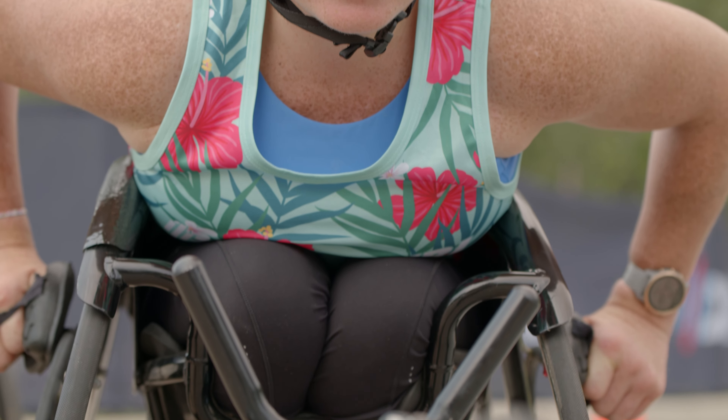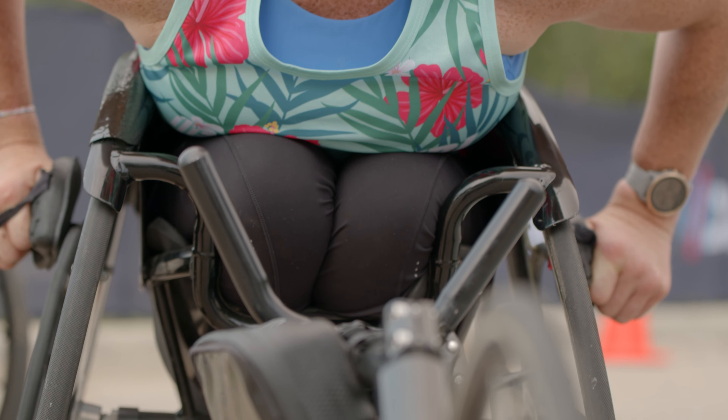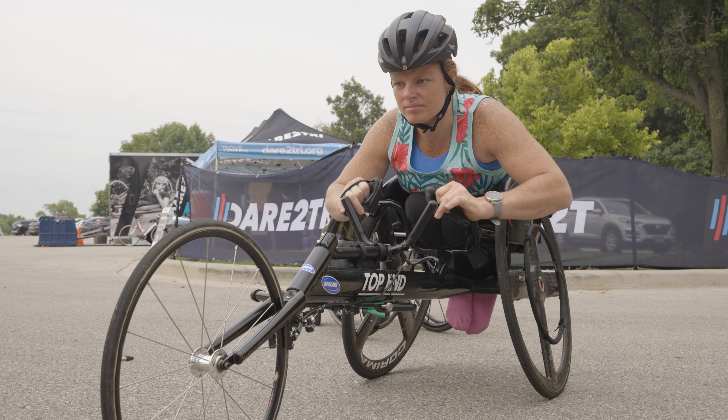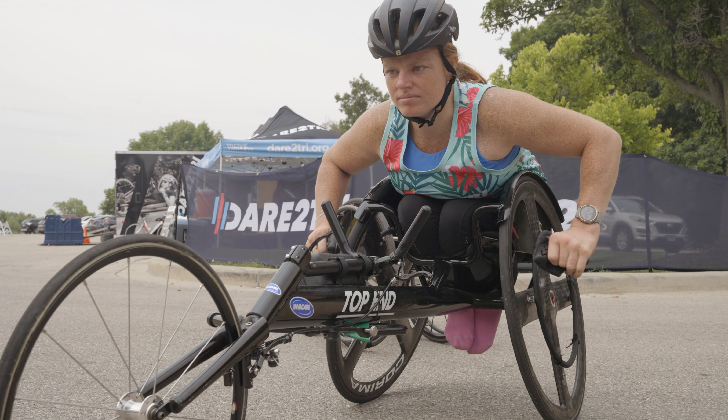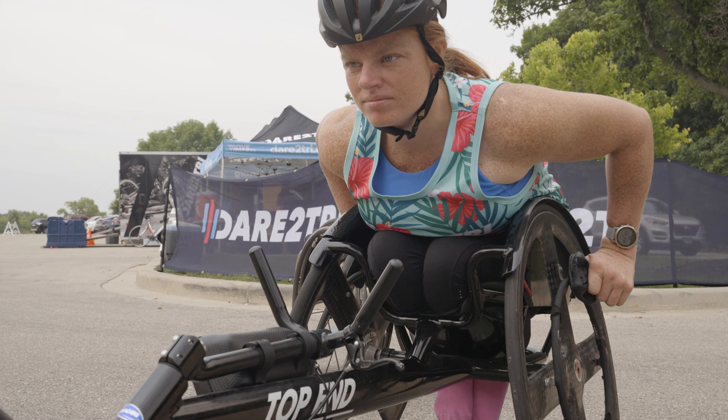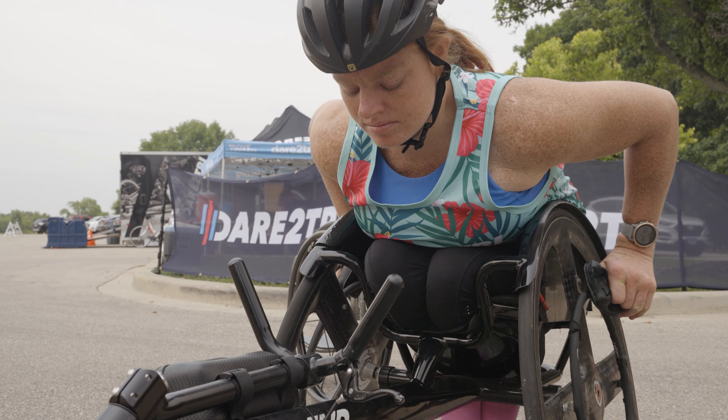First and foremost, it's vital to ensure that your racing chair is properly fitted to your body measurements. The decision to kneel or sit in a racing wheelchair depends on several factors, including personal preference, physical ability, and the type of racing you are participating in.